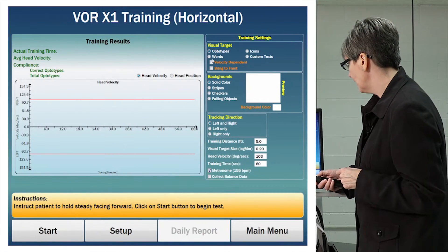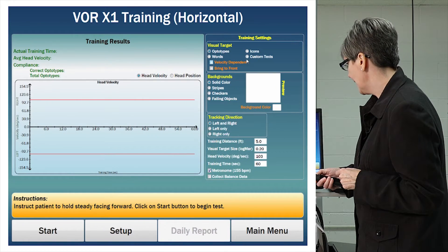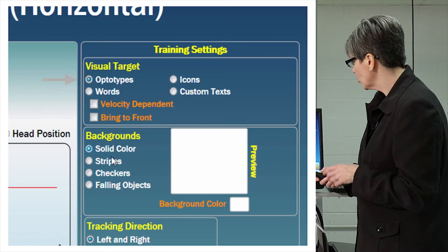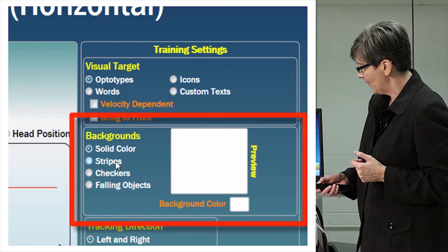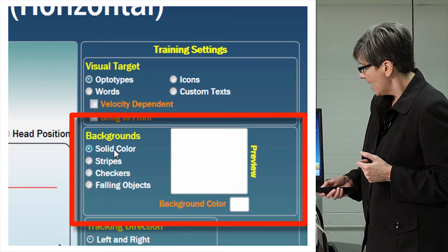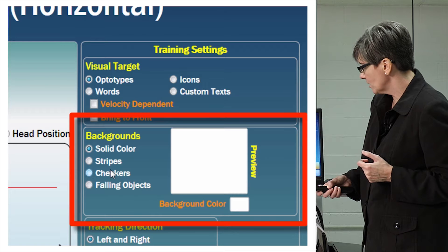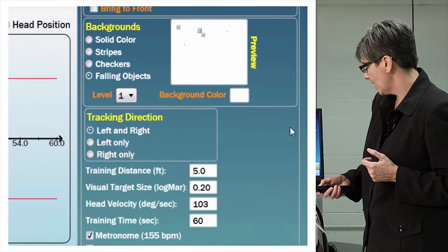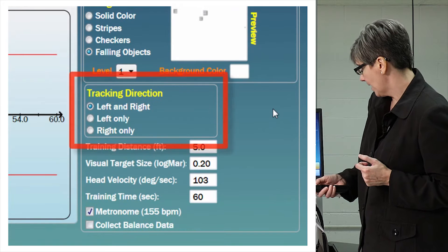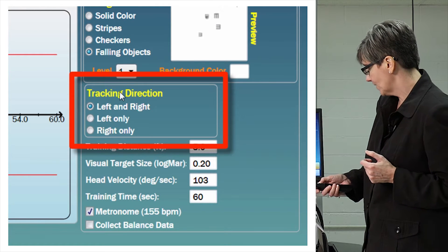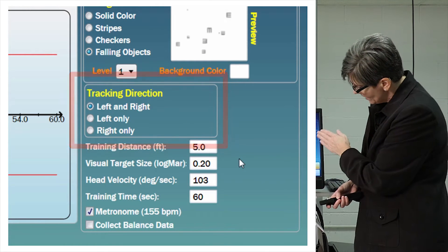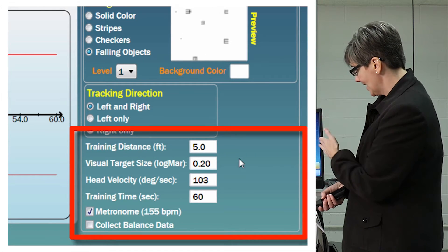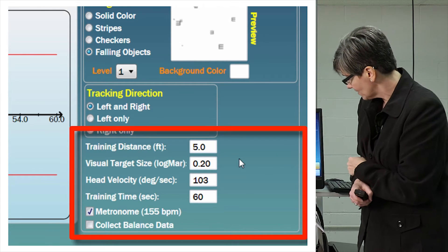We're going to train Mary today with optotypes, and we can choose a multitude of different backgrounds — solid colors, checkers, or falling objects. I'm going to train her with falling objects. We're going to train both left and right. The distance is preset: we tested her at five feet, so her training distance is five feet.